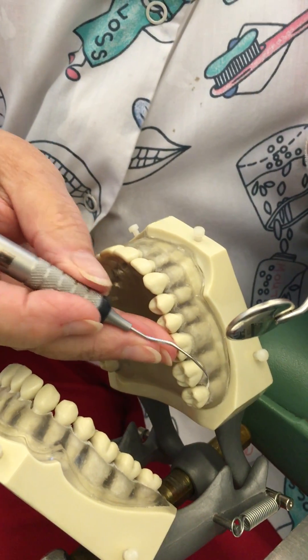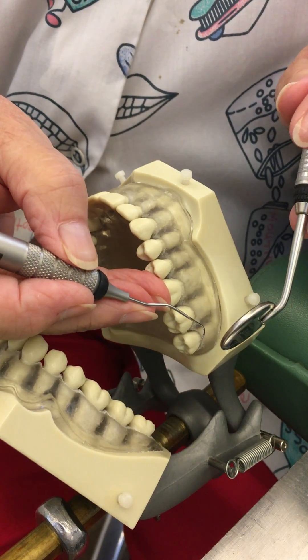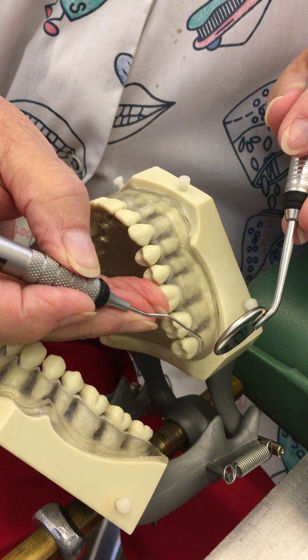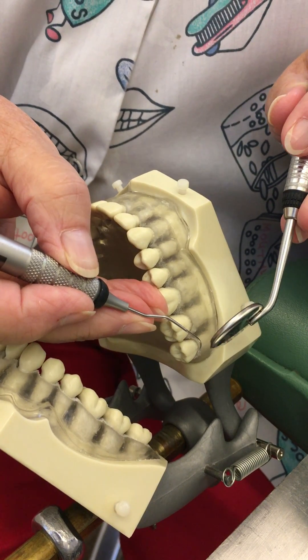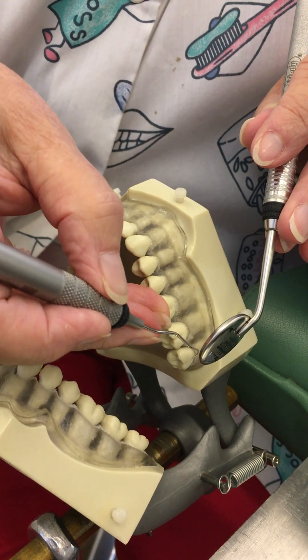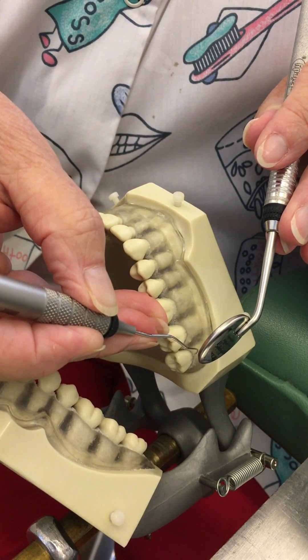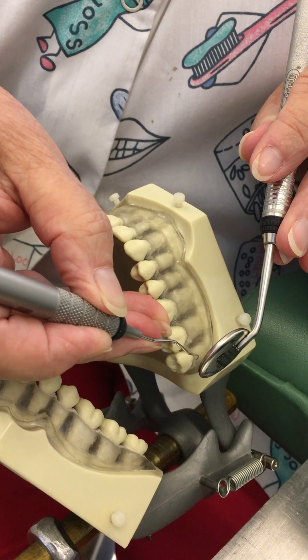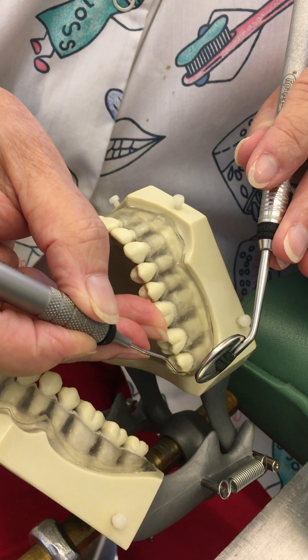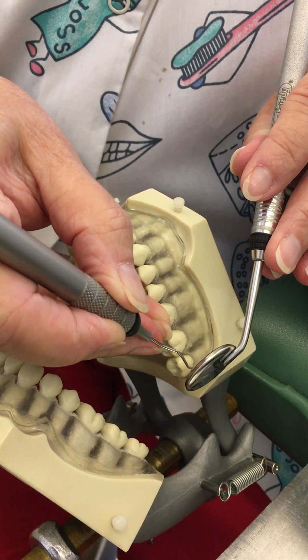For area four, I'm going to go straight across the arch just like we did on the mandible. I'll establish my fulcrum on tooth number 14, extend my instrument, and use my mirror for retraction, indirect vision, and illumination — three things. I'm going to lift up on my fulcrum so my hand works as a unit, and that puts my instrument right at the distal line angle.